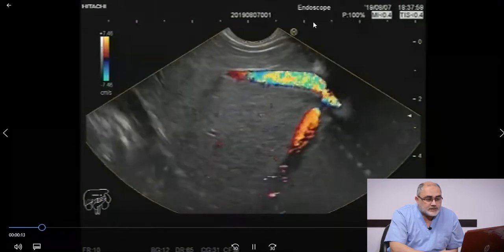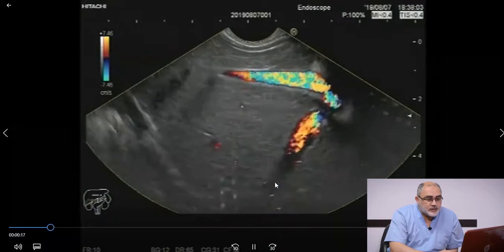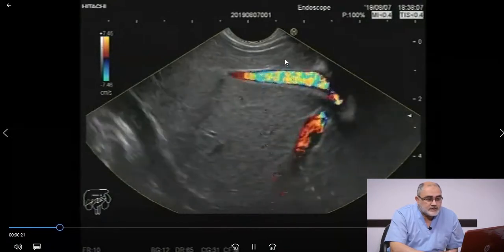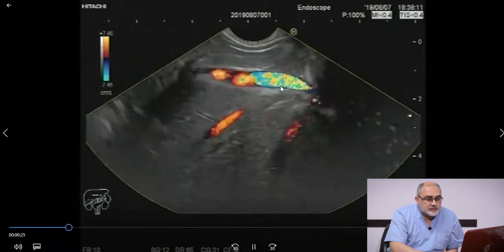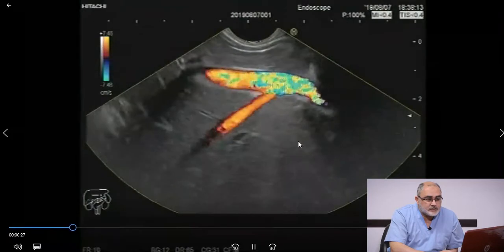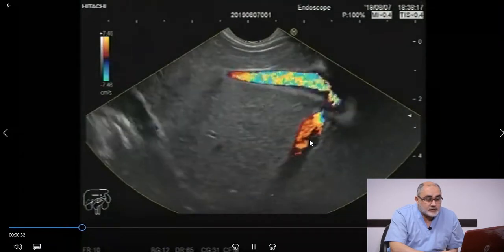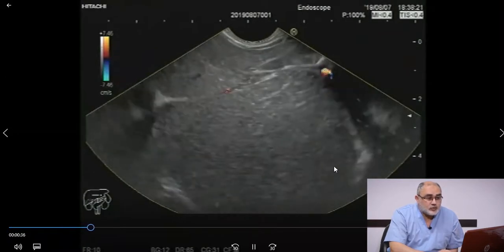diameter is here with gradual tapering when it goes away from the echo endoscope inside the hepatic parenchyma, and this is segment 1, the caudate lobe, segment 8 in between the inferior vena cava and the right hepatic vein, and part of segment 7 deeper to the right hepatic vein. Then we start to do counterclockwise rotation.